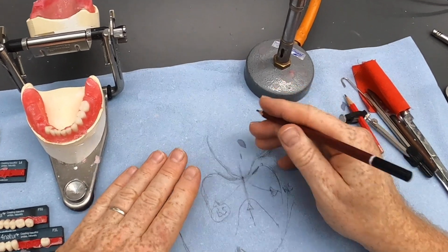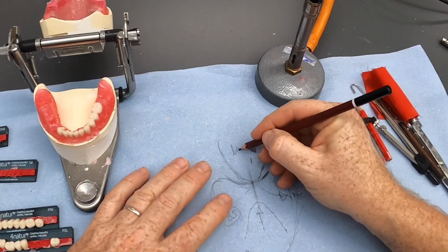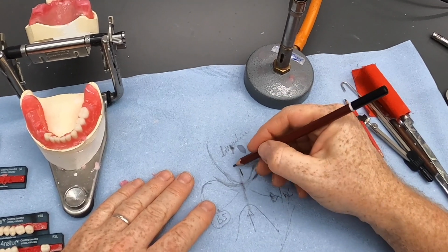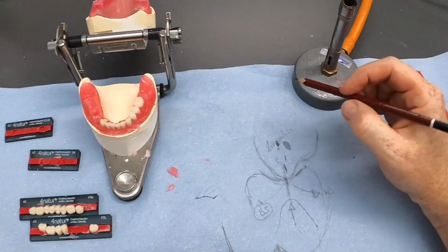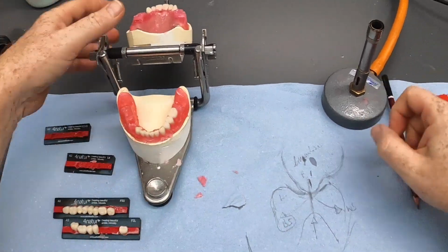set up the teeth and adjust the teeth, both technically and clinically, if we work with this lingualized occlusion. Lingualized because it's the lingual cusp that does the work. We call it palatal in the UK. A lot of other people refer to the palatal cusp as the lingual cusp on the upper. We reserve that for the lingual of the lower.